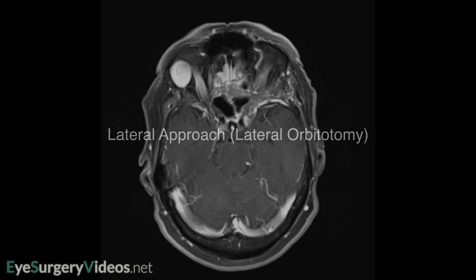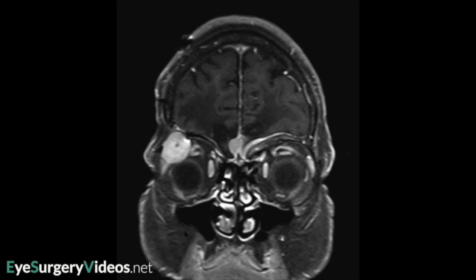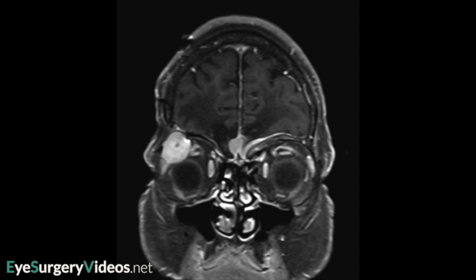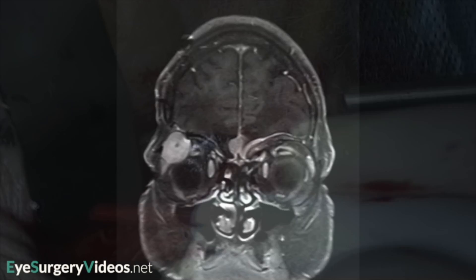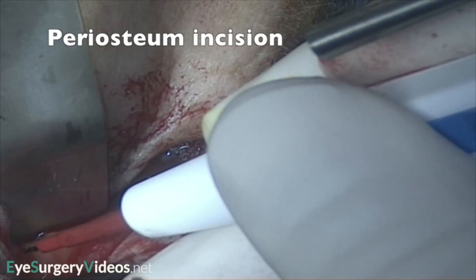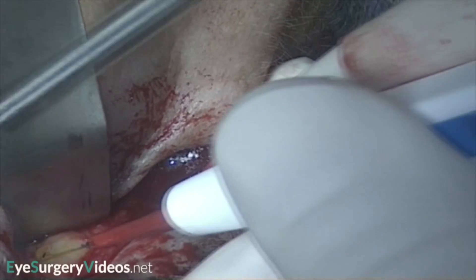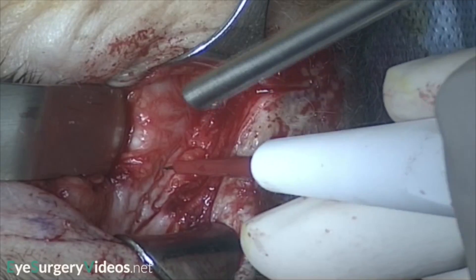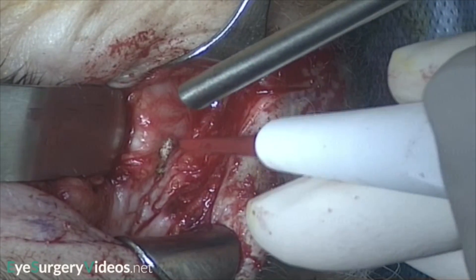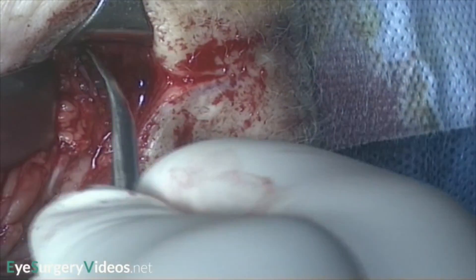The lateral orbitotomy gives excellent access to the lateral and deeper orbit. This patient has a well circumscribed mass in the region of the lacrimal gland. A skin crease incision has already been made, though the same effect could be achieved with the lateral cantholysis and canthotomy. The incision is deepened using monopolar cautery through orbicularis down to the periosteum to expose the lateral orbital rim.